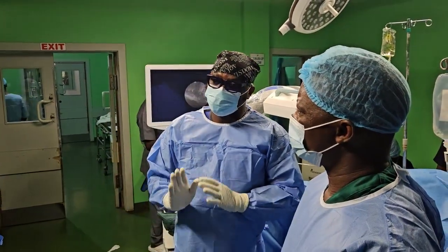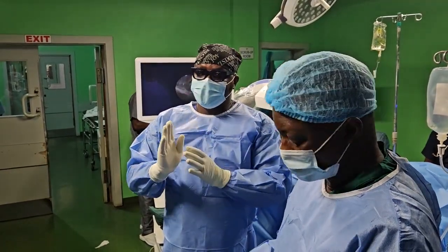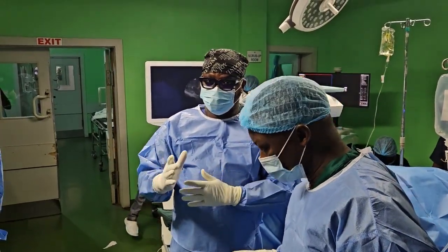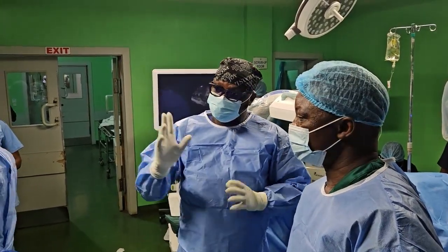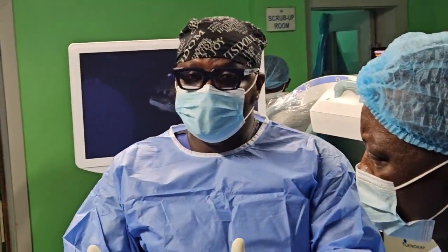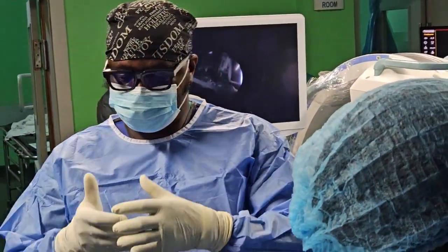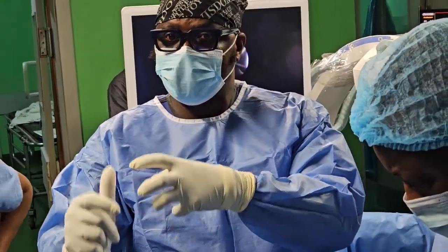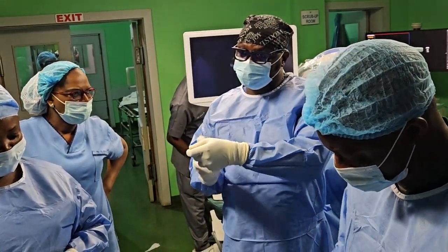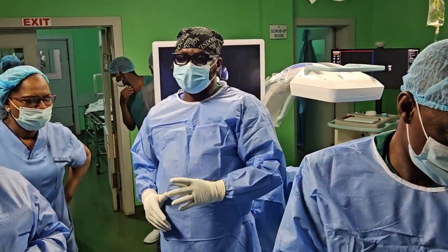It helps me to backload my wire safely. I try to scope as far as I can get. If I get to the PUJ, good for me. I backload my wire securely. I'm seeing that this is where my wire is. Can you expatiate on what you mean by loading your wire? So I scope through the ureter up to the PUJ, pass my guide wire through the scope, and I withdraw my scope. My wire stays there.